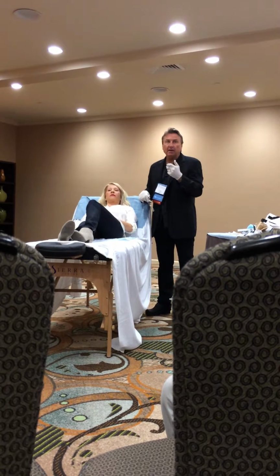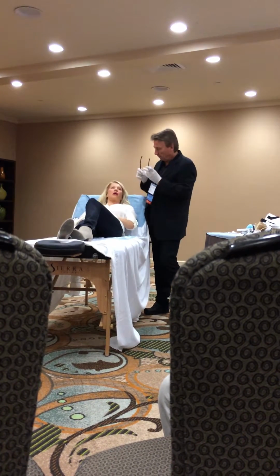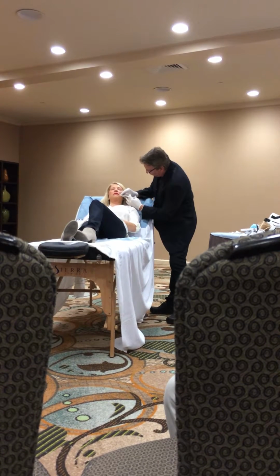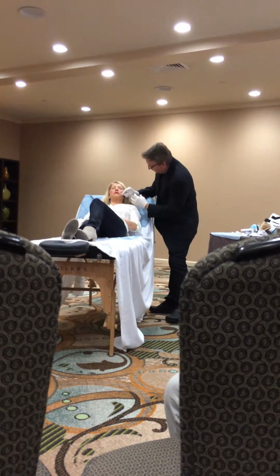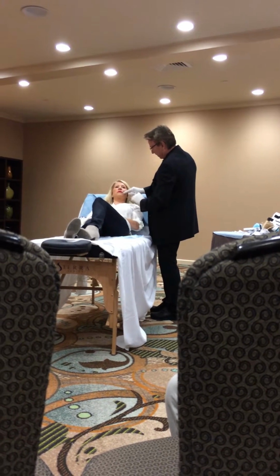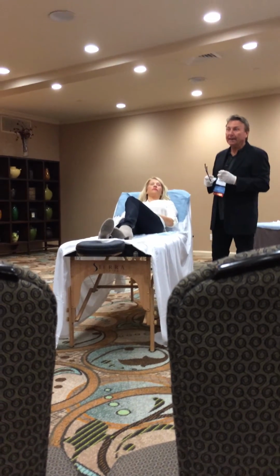Does anybody have anything to add? The commissure is the... yeah, we did that on the last one. Where do you place that to raise the corner? I'll go in right here, and I'll go pretty superficial. You inject it right at the corner? Yeah, I do. But I'll also, as I said earlier, inject it up this way to try to get a little bit of a curl in the lip. I know on her that's going to work, but on somebody who is down like this, you can try it.